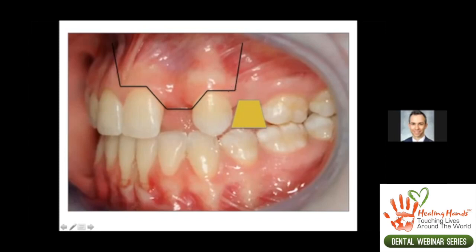And in this approach, it's papilla sparing, and we can release this. And again, it does require careful closure with a small tapered needle. I typically use 4-0 Vicryl sutures for this, and get a nice closure. And I saw this in several articles in a meeting, and this is currently my preferred way of raising the flap.